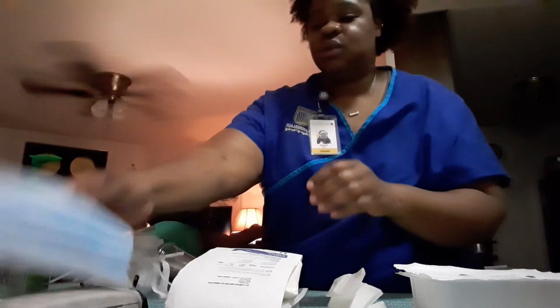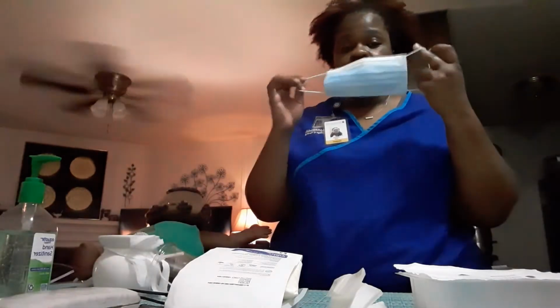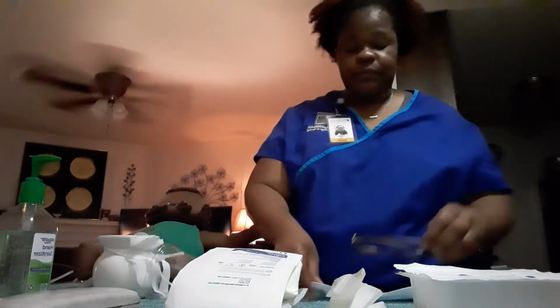Next, I'm going to perform hand hygiene. I am going to put on my mask. Will show that I'm putting this on, but I'm not actually going to put this on. But I will have this on the entire time. And I also would have protective eyewear on the entire time while performing this. But I'm going to leave that off for now, but I would have that on. Next, I'm going to open up all my supplies.